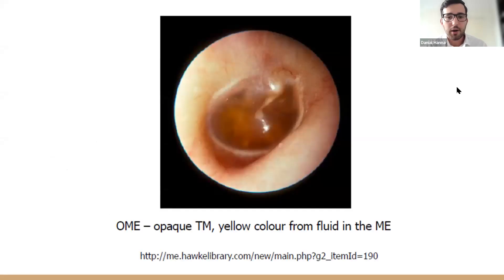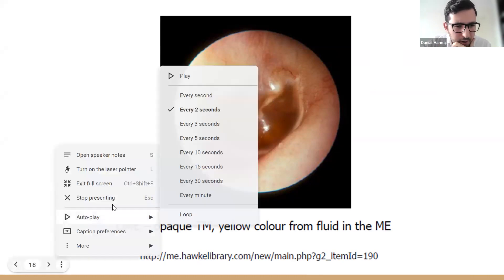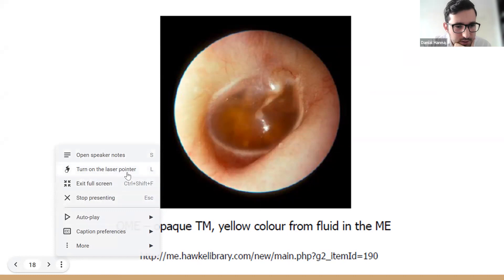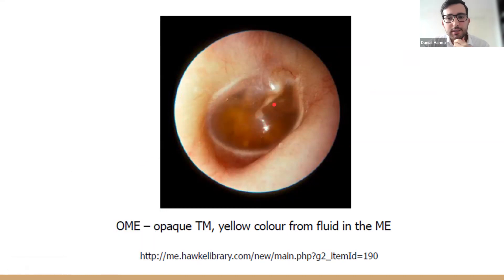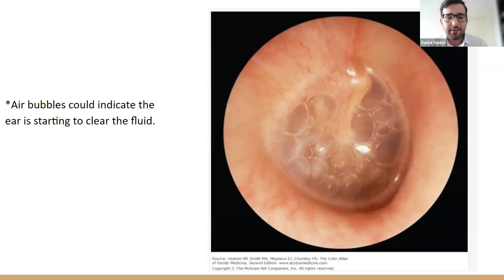Here is a picture of a tympanic membrane with otitis media with effusion. We can see the opaque tympanic membrane and yellow coloring behind the eardrum. The cone of light and the malleus are visible, and the yellow coloring indicates possible effusion behind the eardrum. When the ear begins clearing from the fluid, air bubbles appear — an indication that the eustachian tube is starting to work again and clearing the middle ear from the effusion.